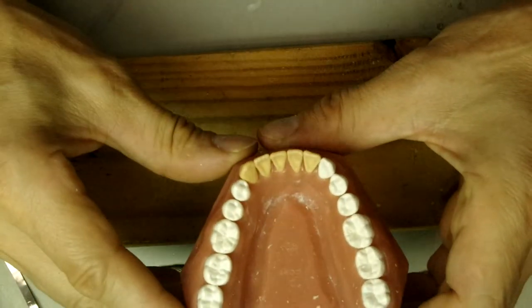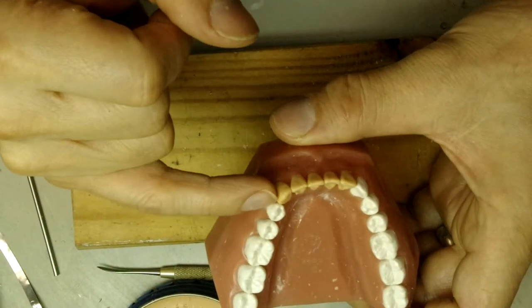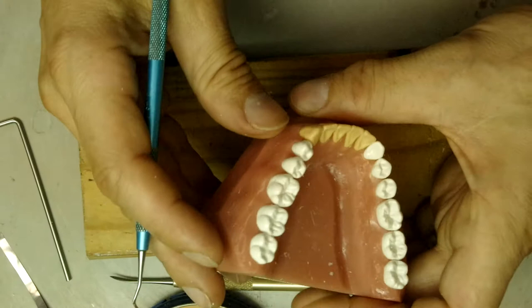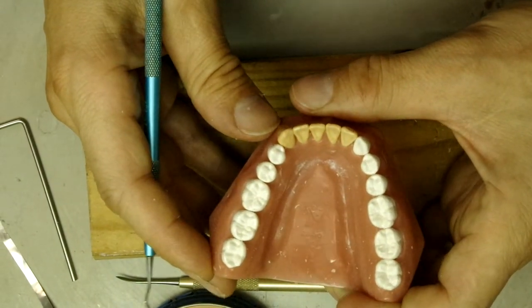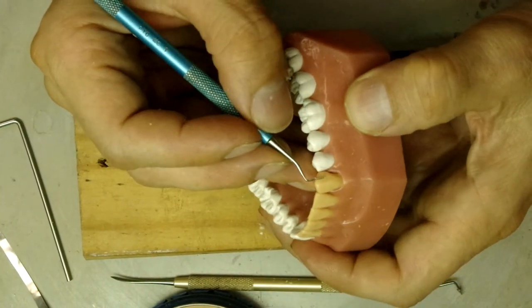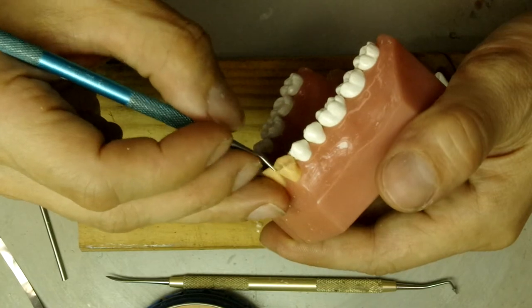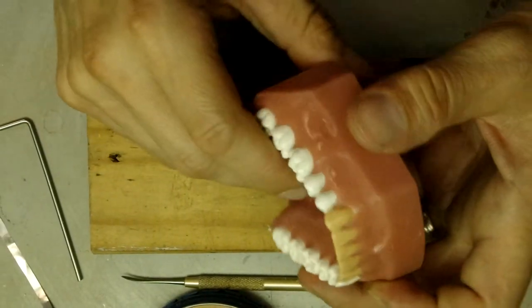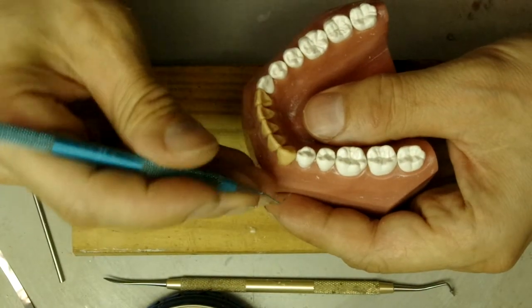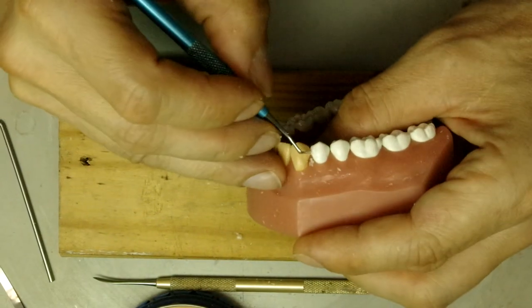And there you go. Now we look at it from the top, and I do notice that it is a little bit far out on the distal here. You see? Right there. Just a tiny bit. So we're gonna round in this embrasure a little bit. So that should do it. Remember, the distals on the canines should be tucked in.